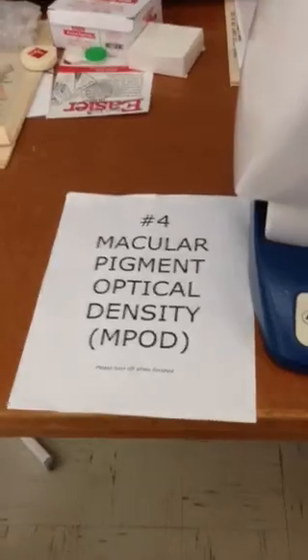The test is now repeating. Normally you would test the left eye, and the right-hand dot would turn red and you'd fixate there for the peripheral left side of vision. So that's really all you need to know for the M-POD. I hope that was a useful video for you. Thank you very much.